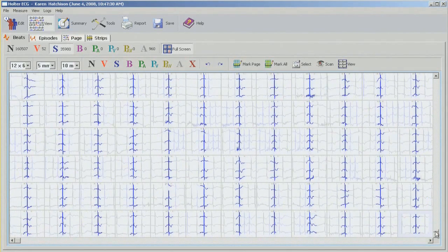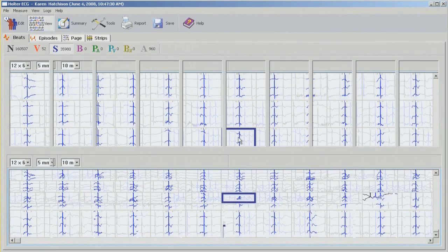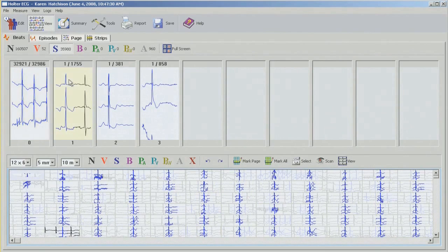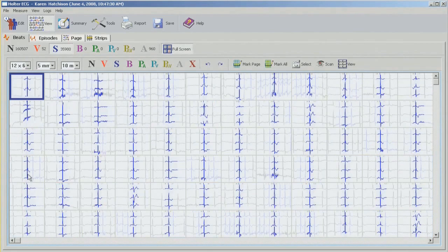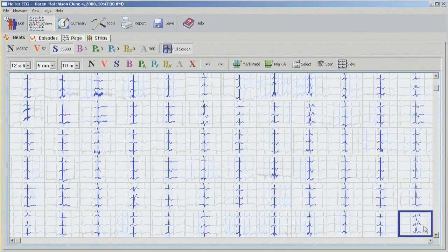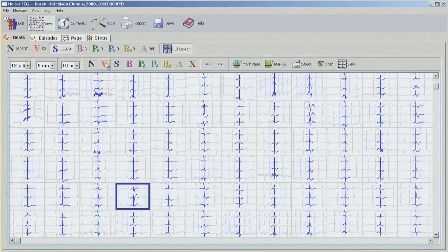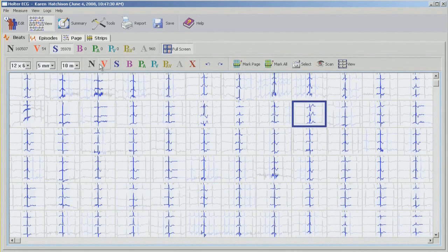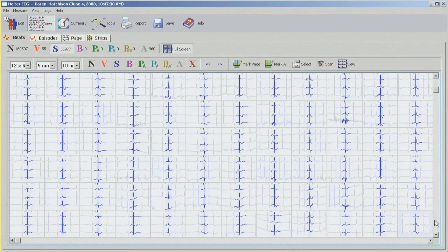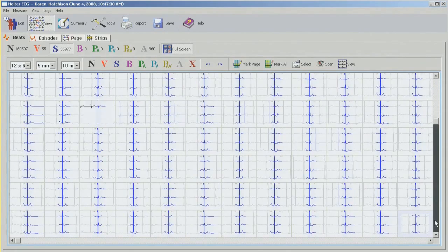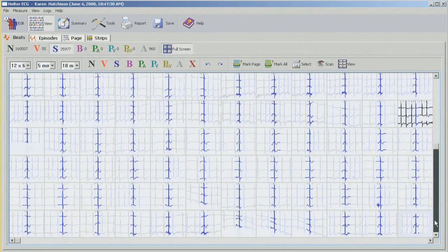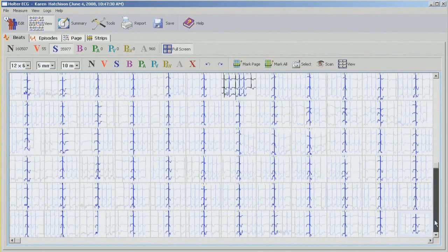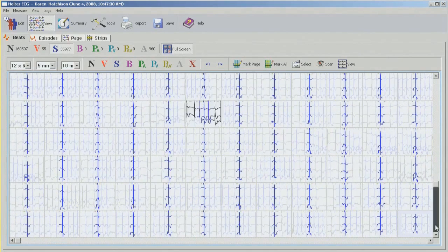So I'm happy with this. Then again, tag any of the boxes and use the Z button to get out of there. Moving on to the next one. I'm just going to repeat the same thing. Now there's a ventricular beat here, which I want to change. So I'm going to untag the first one and tag this one here. Change to ventricular. And there's another one here. And moving on.